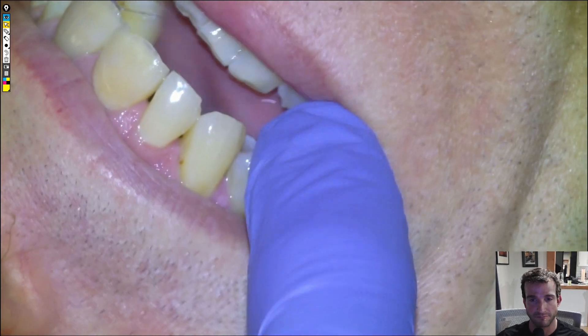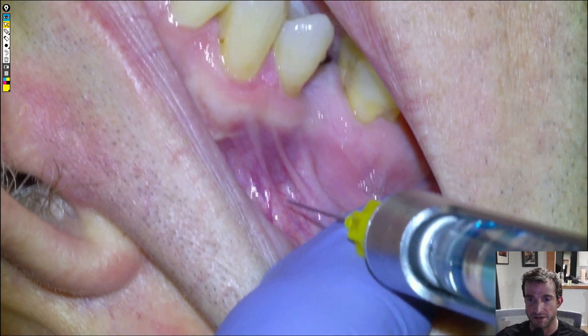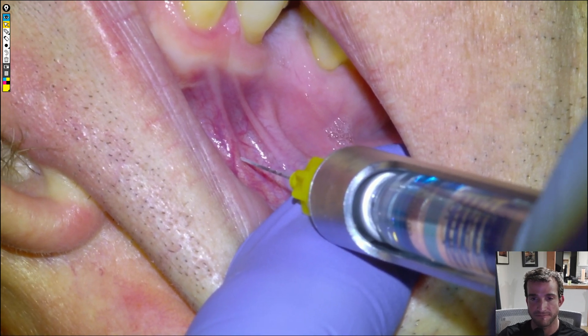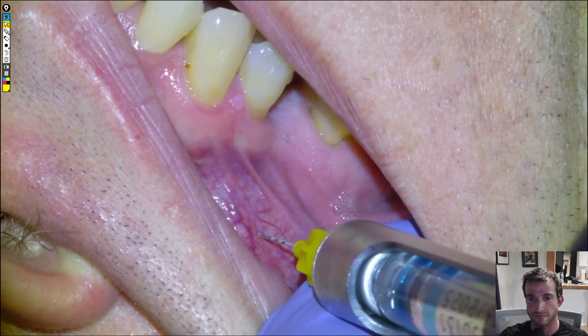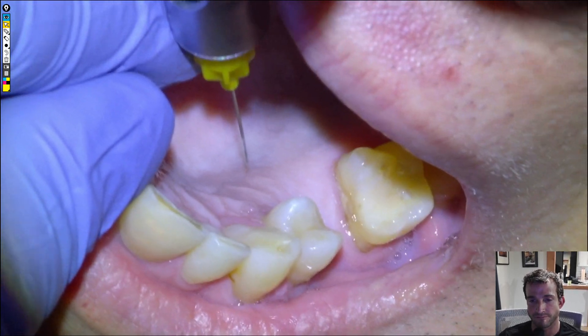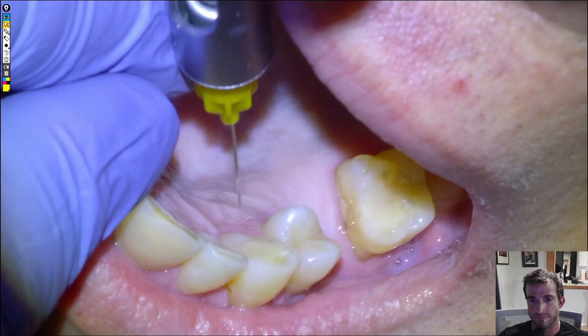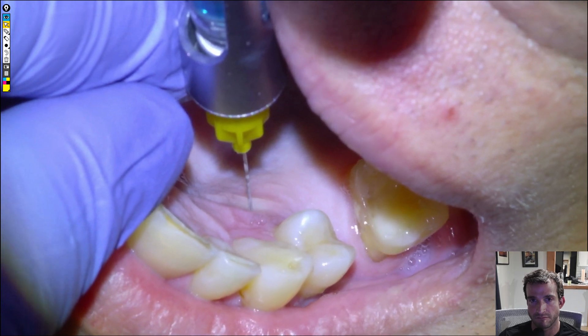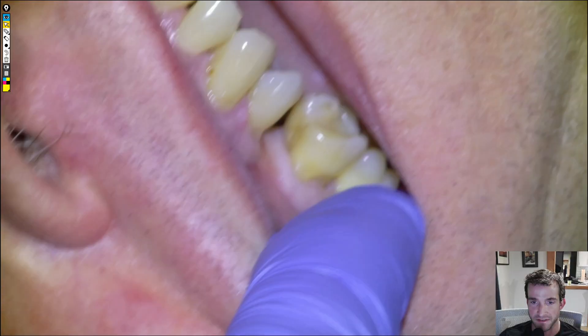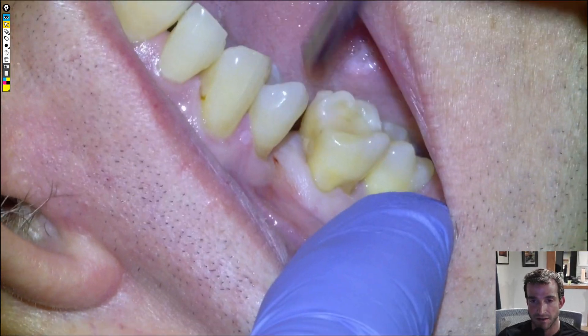We'll freeze with 1-200 Articaine, give half a cartridge into the buccal — let's speed it up here. Okay, there — you didn't feel any of that, good. It's the first premolar, also called the four. Big open, look to the right — really sharp pinch here — a quarter cartridge of anesthetic into the palatal. Yeah, that's a big ouch. Then we'll get started once the freezing settles in.